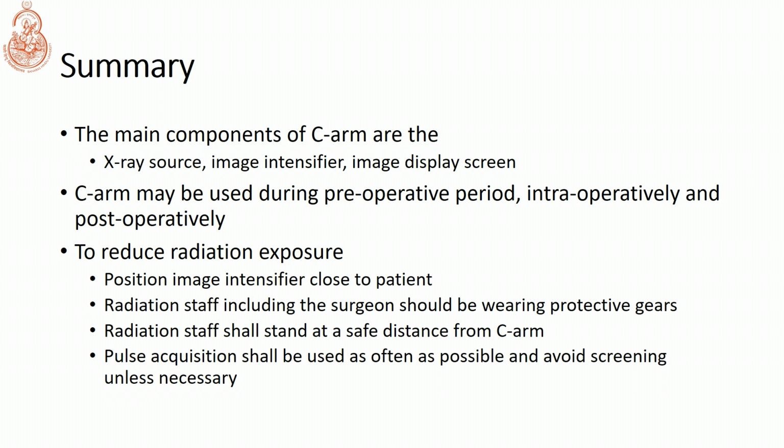Apart from this, we shall always keep in mind the ill effects of this technique, and we shall always take proactive steps in reducing the radiation exposure. How can we do that? By positioning the image intensifier close to the patient. The radiation staff, including the surgeon, shall always wear protective gear as well as radiation dosimeters.